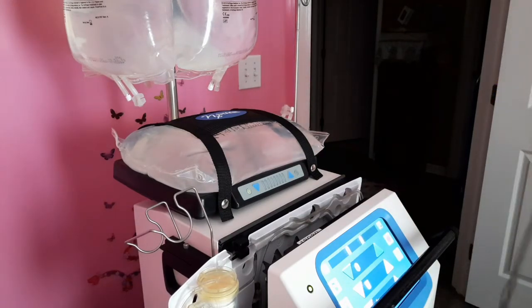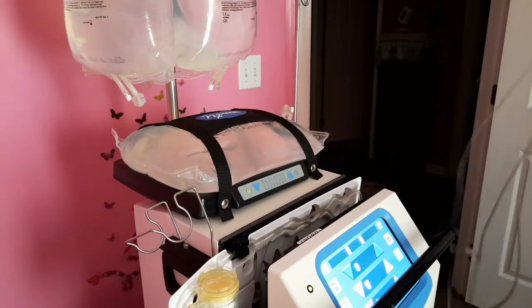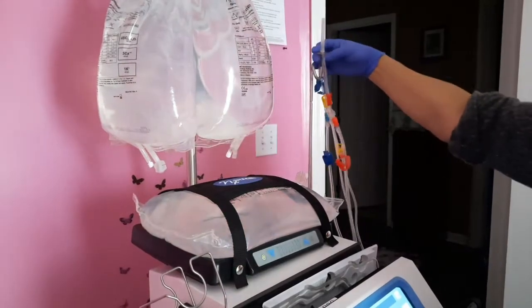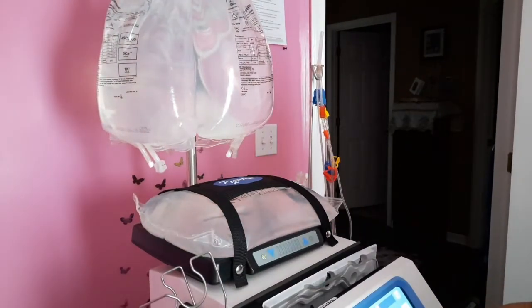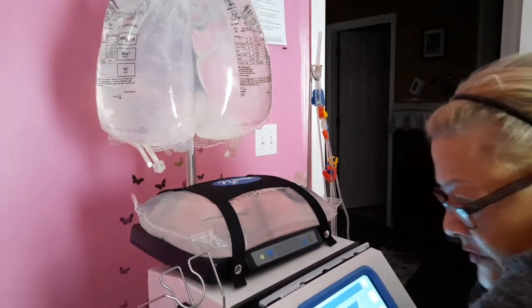But like I said, it's just the way it's been wrapped. Alright, so I'm just trying to feed my lines up here as best as I know how to do. Alright, and that is it. So now I'm going to hang up the spike on there, okay, while I close the cycler door, making sure all the cords are away from the door so I don't catch anything. I'm going to push and then push down, okay?